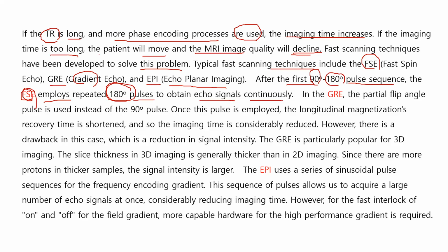We will explain in detail the FSE pulse sequence, where we use repeated 180 degree pulses after the spin echo pulse sequence.